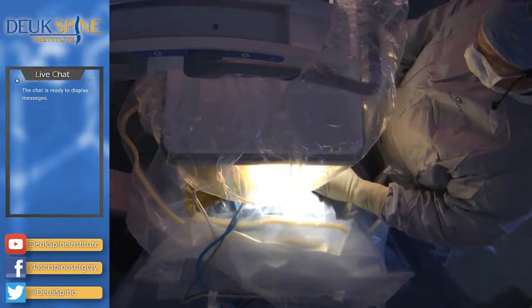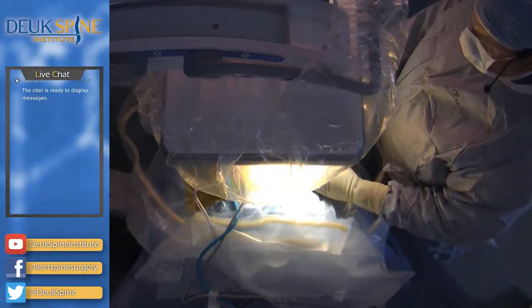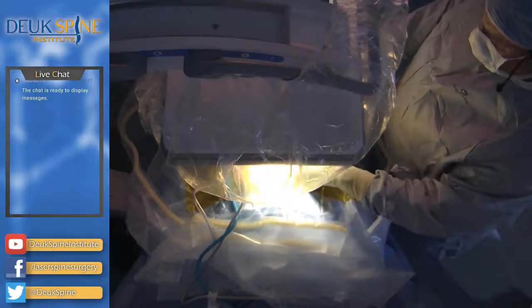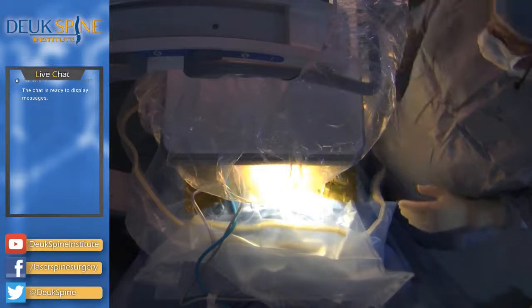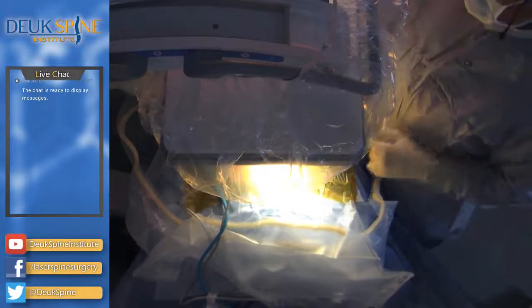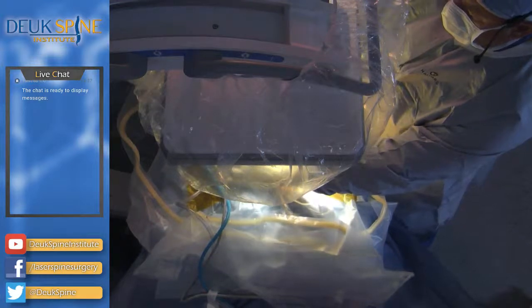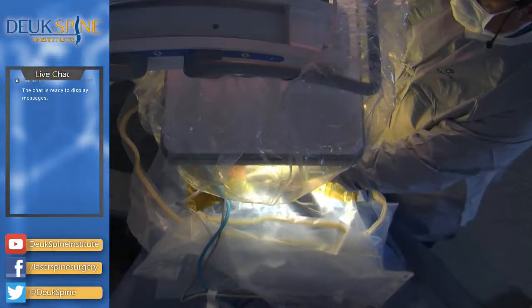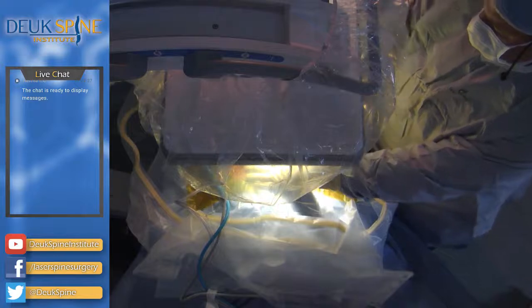I apologize. Do we try any bicarb? No, this one, sir. Next time? Yes, sir. All right, he said it was a 10%. Yes, right, 10% bicarb? And left, we said, was 4-5, 5-1. Right is 3-4. Is that correct? Yes, sir. Right? We're all in agreement? I know. Okay, so our patient, we're going to be fixing 3 discs.